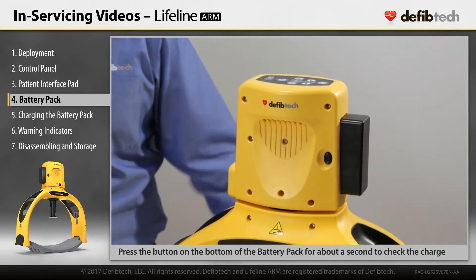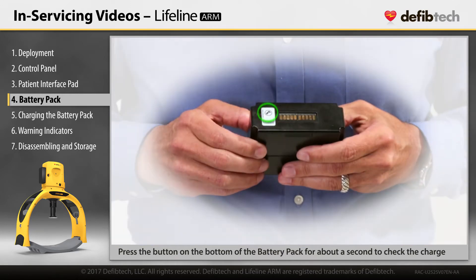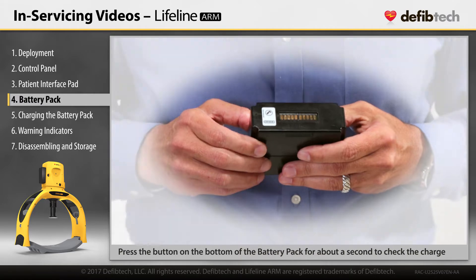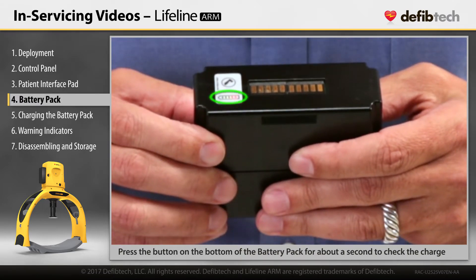To check the charge of a battery pack when not installed in the device, press the button on the bottom of the battery pack for about a second. The battery pack indicator will show the amount of charge remaining.